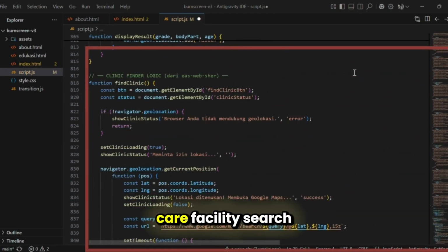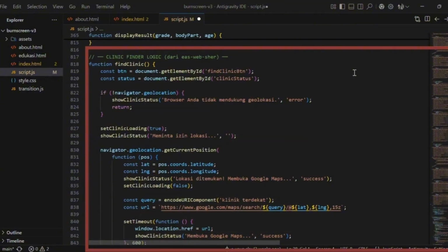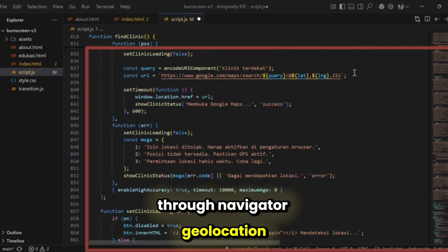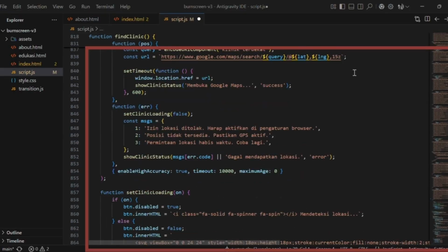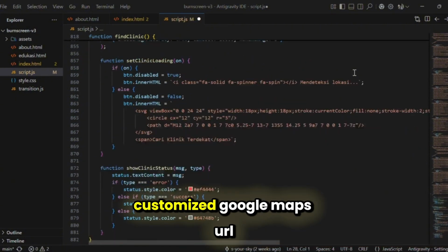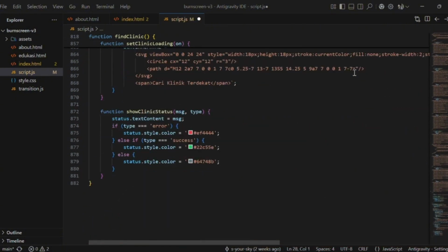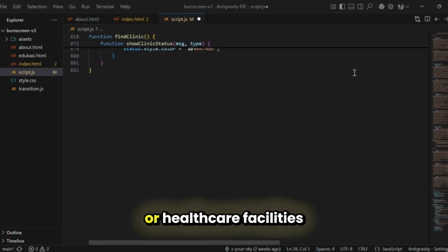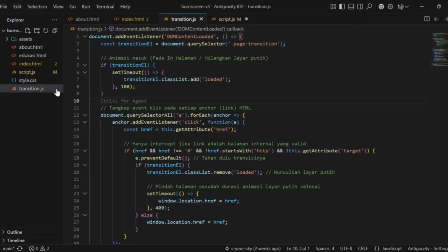Finally, the healthcare facilities search feature utilizes the Geolocation API through navigator.geolocation.getCurrentPosition. The application retrieves the user's real-time coordinates and uses them to generate a customized Google Maps URL, enabling users to quickly locate nearby clinics or healthcare facilities.